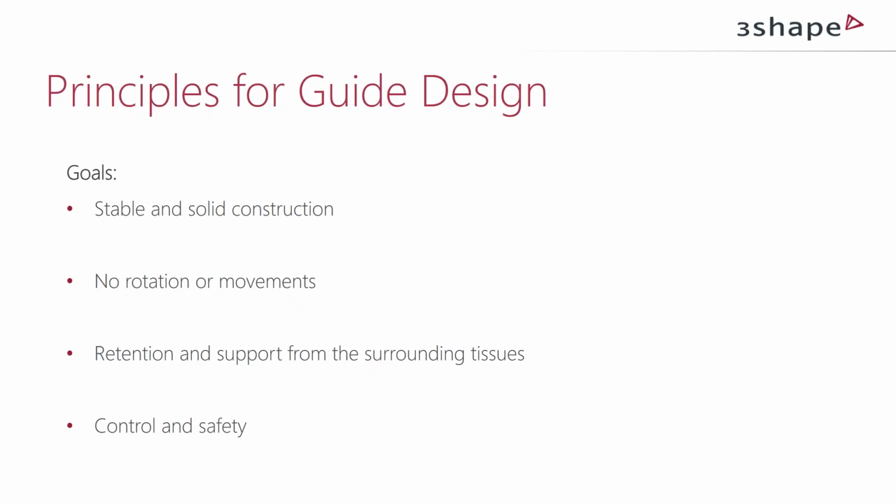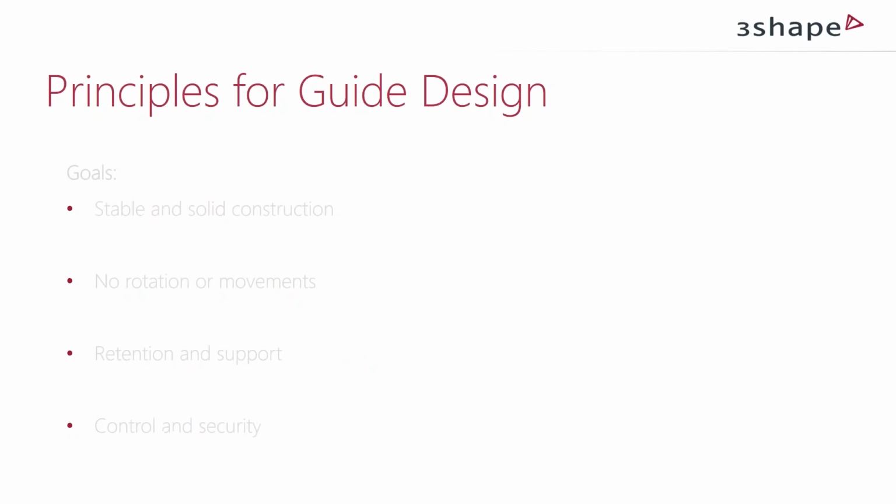but to be able to do this the best way, we also need the help from the dentist. We need a very, very good scan for this. And some of you might remember that we have made some videos and showed in earlier webinars how to scan for surgical guides, the small series. Maybe you, Berk, can remind us of what happened there.